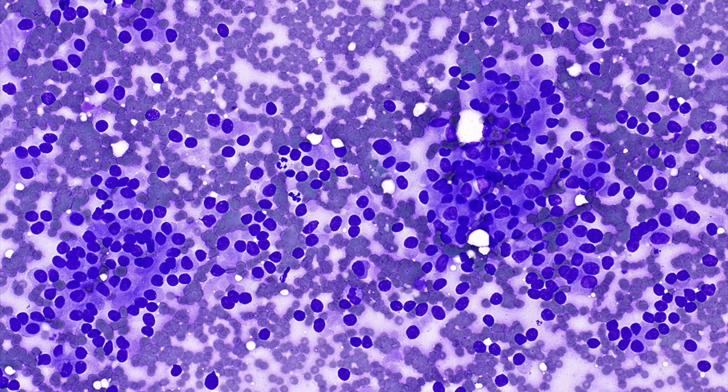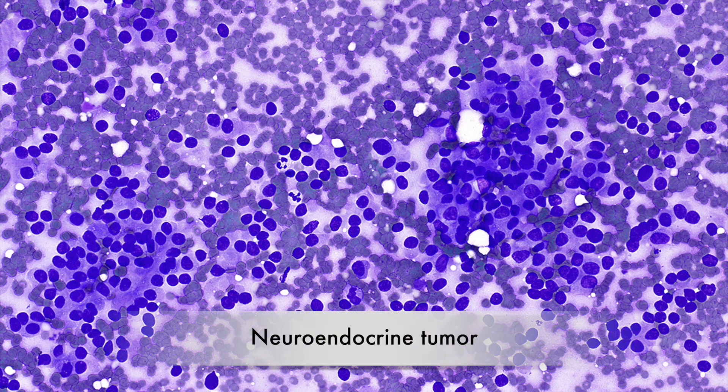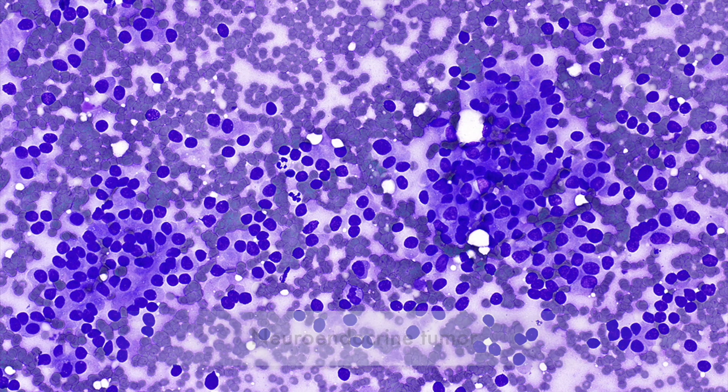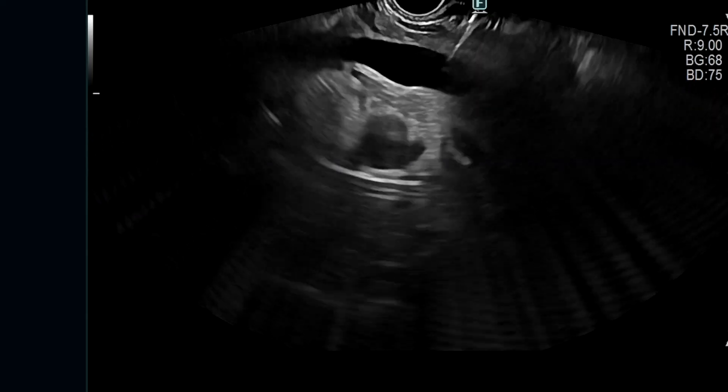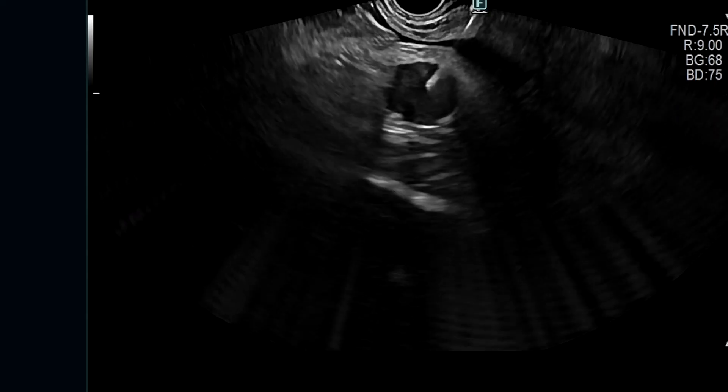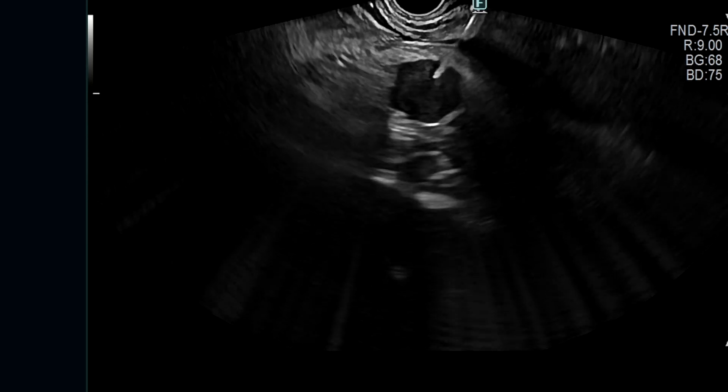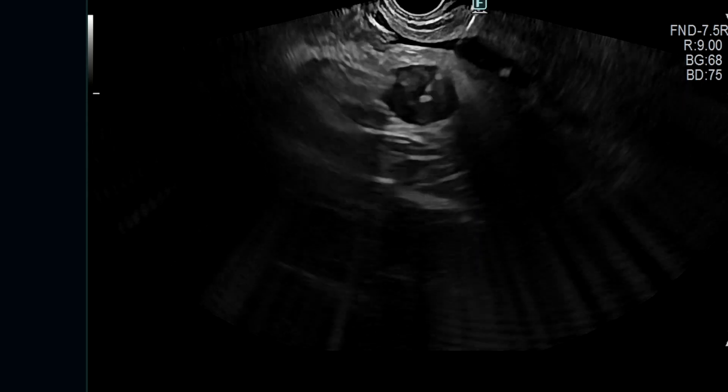Rapid on-site evaluation showed a neuroendocrine tumor. A second pass was then performed to procure a specimen in cell block for ancillary studies.